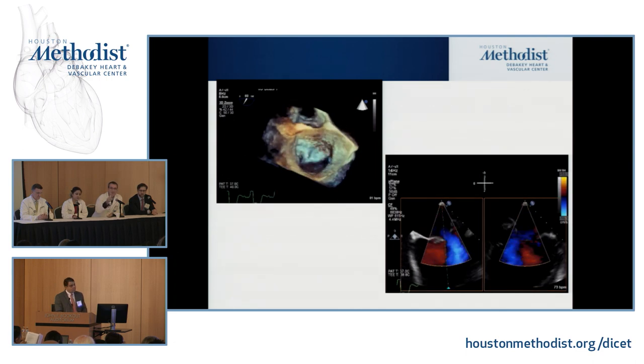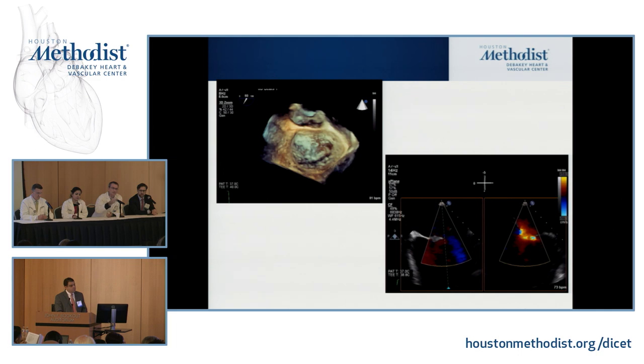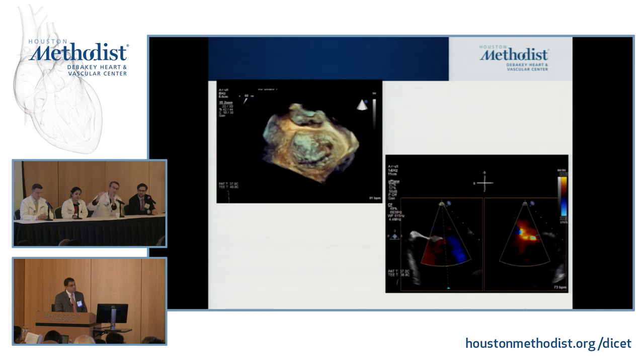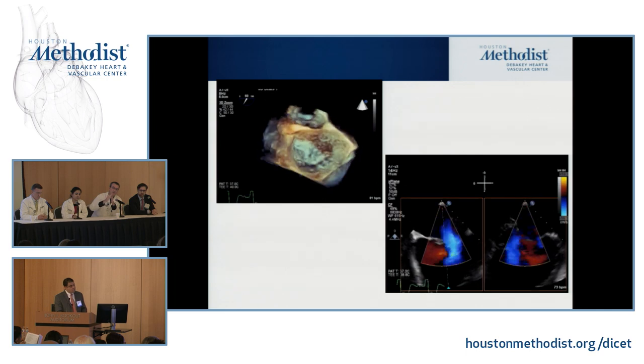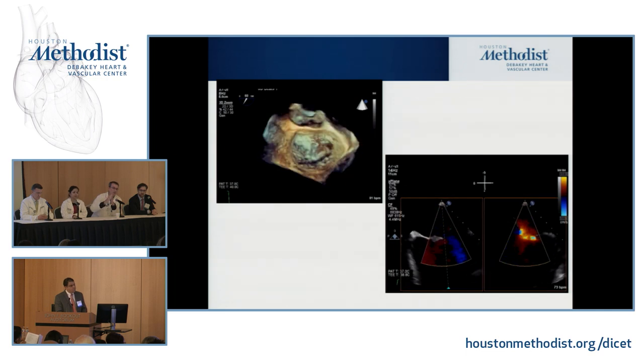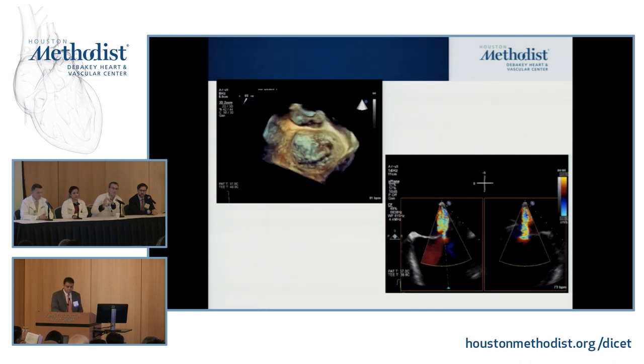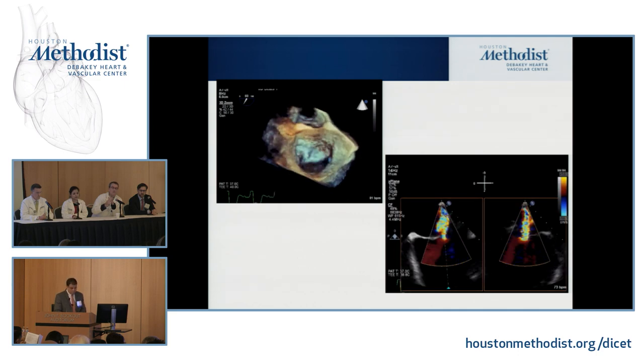That's why it's called a mitral clip. And what that does is it improves the coaptation because the leaflets have been pulled apart by a sick ventricle. So you're sort of forcing the center of the leaflets to still touch. All you're doing is reducing the amount of mitral regurgitation. Expectation is you go from severe regurg to probably mild. You generally never get to zero regurgitation.